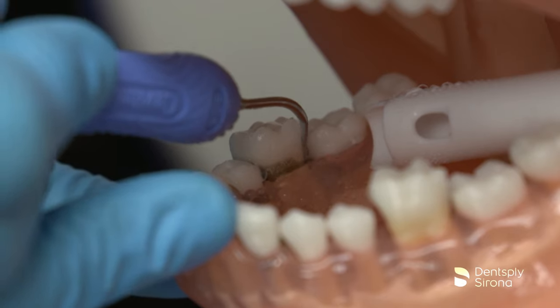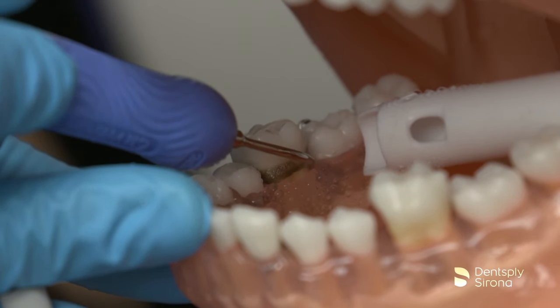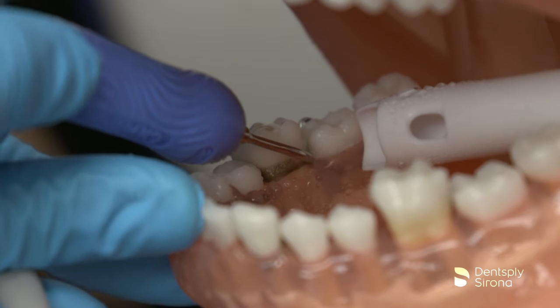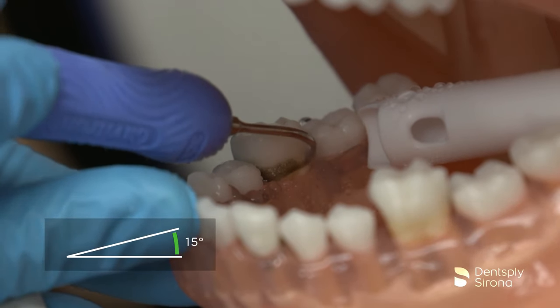The clinician begins instrumentation by adapting the lateral surface of the Cavitron FSI-100 on the clinical crown and uses the back and/or face of the insert tip as needed. The clinician demonstrates a transverse oblique approach, maintaining 2-3 mm of adaptation and 0-15 degrees angulation.